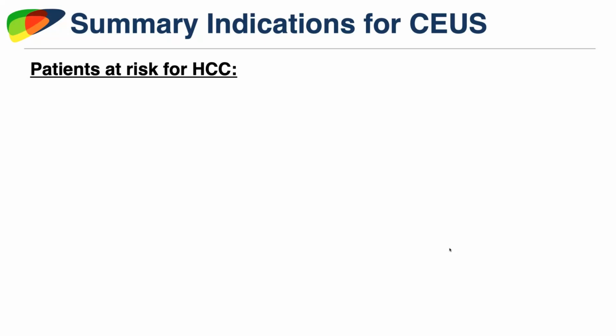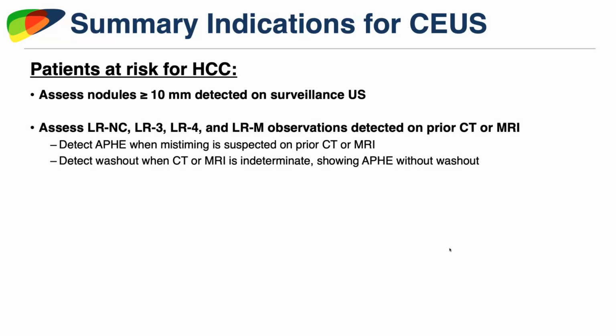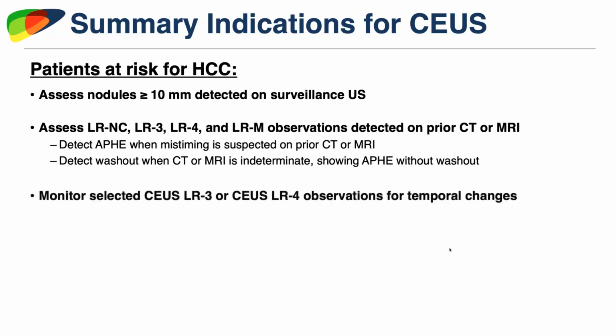So in summary, here are the indications for contrast-enhanced ultrasound. Consider it for assessing any nodule seen at surveillance ultrasound greater than 1 centimeter. Consider it to further characterize LR-3, 4, and M observations detected on prior CT or MRI, to help further characterize them or to guide biopsy and other interventions. Use contrast-enhanced ultrasound to follow observations over time to assess temporal changes.